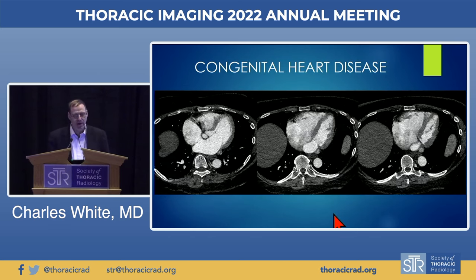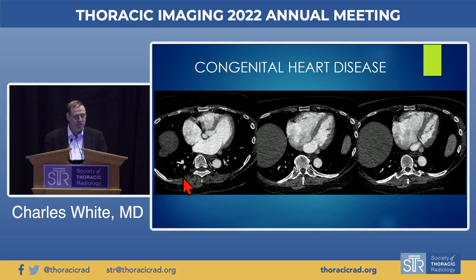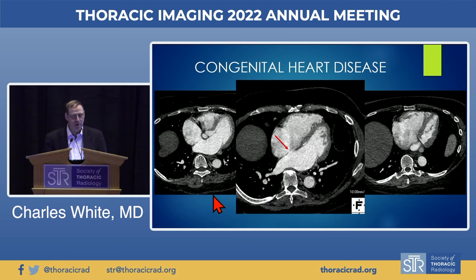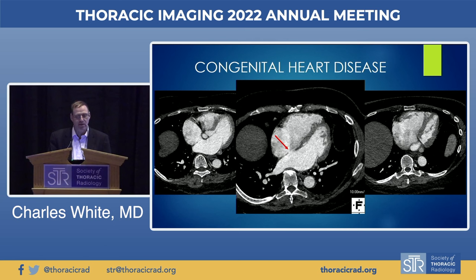Congenital heart disease is another important area, though not all cases are difficult. Shown here is a patient where the finding is better seen on reconstructed four-chamber images: a defect in the atrial septum — a secundum-type atrial septal defect. This is the most common congenital heart disease in adults, whereas VSD would be more common in children.